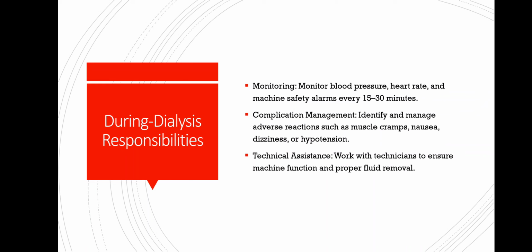Then during dialysis responsibilities. First one, monitoring, then complication management and technical assistance. Monitoring means monitor the blood pressure, heart rate and machine safety alarms every 15 to 30 minutes. Then complication management, like identify and manage the adverse reactions such as muscle cramps, nausea and dizziness or hypotension. Technical assistance means work with the technicians to ensure machine functions and proper fluid removal.